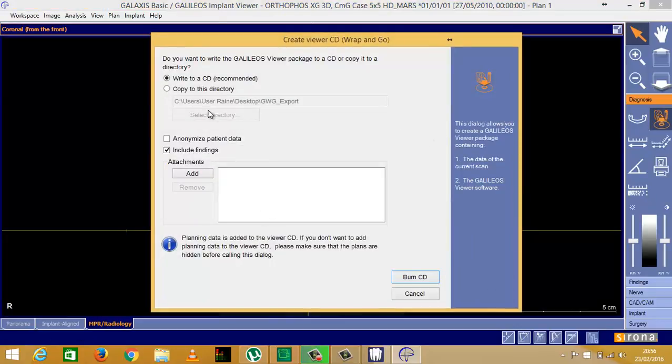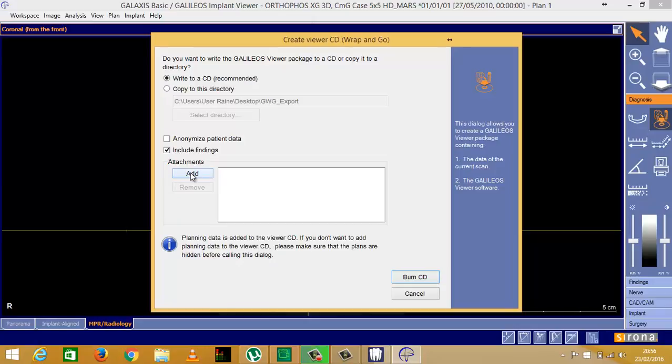It talks me through what to do. Write to a CD, include findings, OK, anonymise patient data if I want to, attachments. If I wanted to add a photo of the patient or anything like that, I can do that. Then I would burn the CD, and that gives me a CD that I can give to the patient.